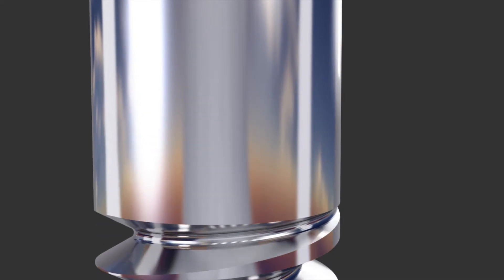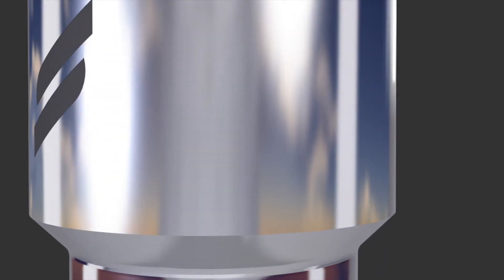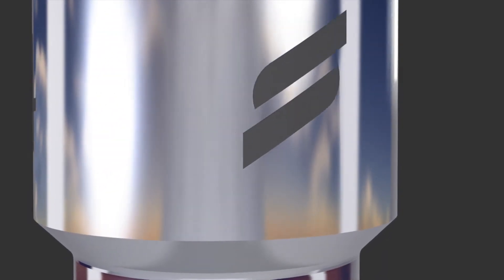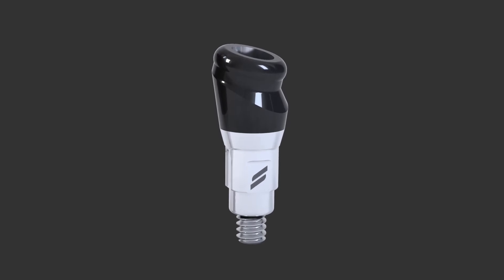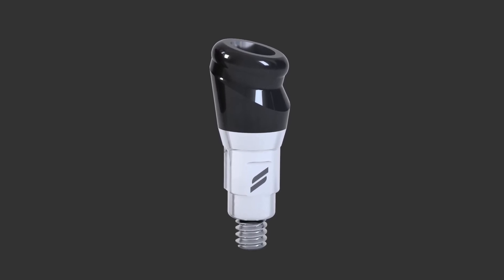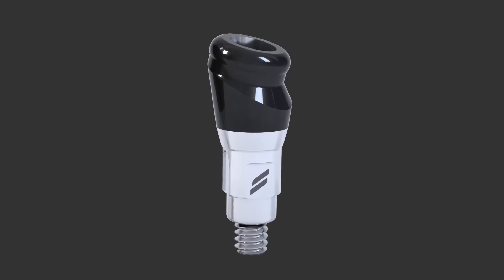There are three main advantages. One is that it has a surface that makes it more wear-resistant. Secondly, it has an option where you can correct angulation, so if implants have been placed with a diversity of axes between them, you can now, to a greater extent, overcome that. It also has an aesthetic option, whereby if space is limited within a denture, you can hide the component because it's white rather than metal-coloured.